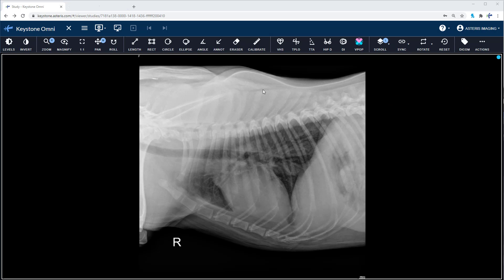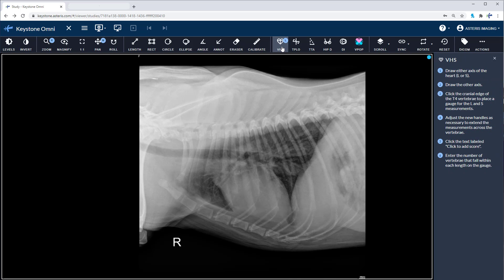Simply log in and pull up a lateral thoracic radiograph. Click the vertebral heart score icon on the Keystone toolbar. You'll see the instructions prompt to the right of the viewing suite.